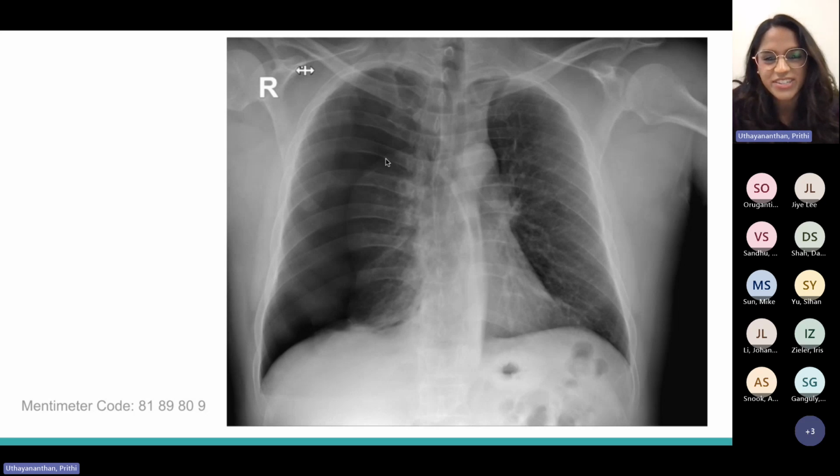Okay, so I'll just go through it. I think it's the first one. If you look at the lung markings here, you can see the white wispy bits go all the way up to the end of the left lung field, but here they stop. So you can see there's an outline here, which shows that there is a pneumothorax on the right side.